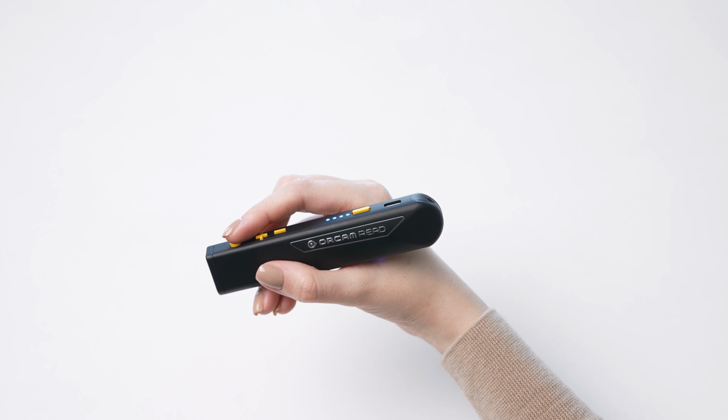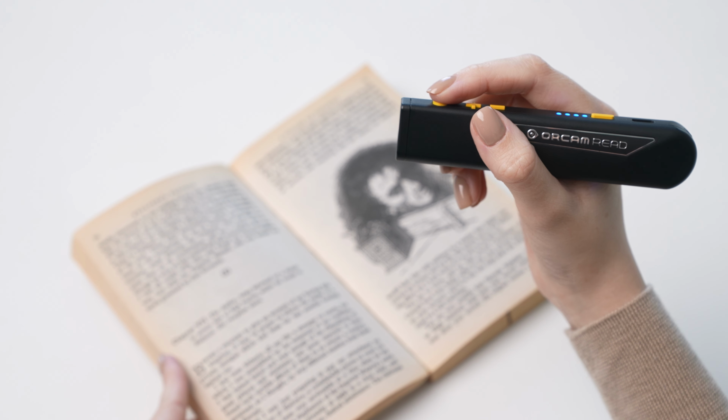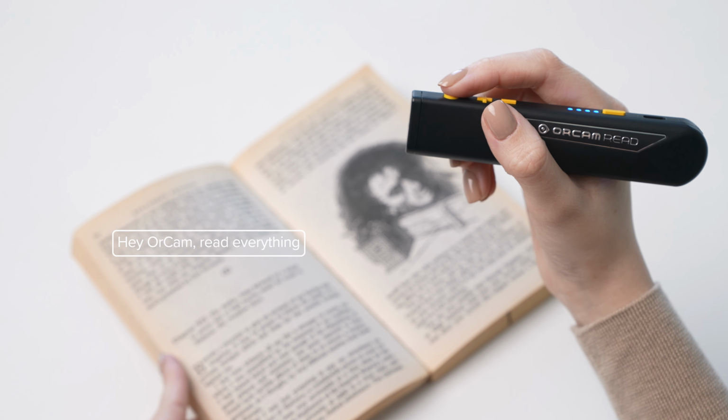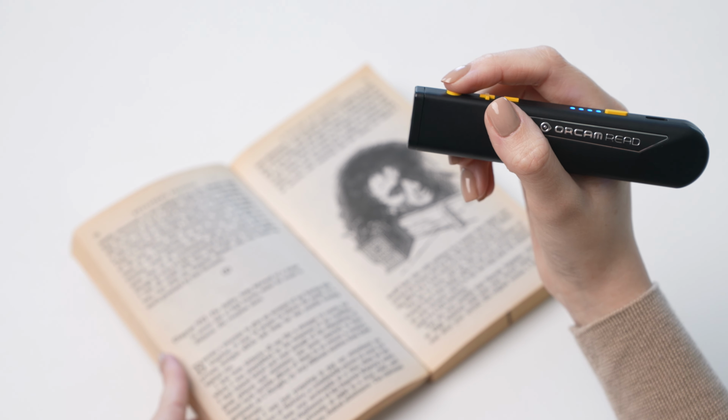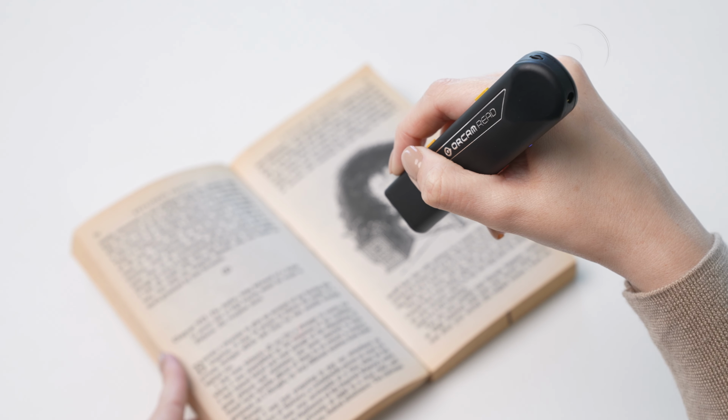To use the smart reading option, simply say, "Hey OrCam, smart reading," followed by what you want it to do. For instance, if you want the device to capture a full page and read the text, say, "Hey OrCam, read everything." The device will ask you to take a picture of the text you want to read, and it will then read it all back to you.